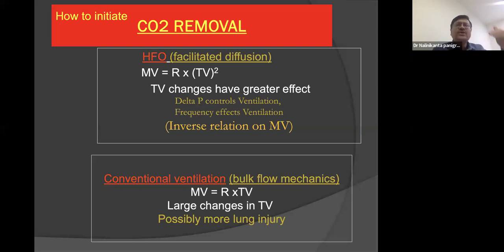You review the previous MAP, how much have you used? Decrease MAP by 1 cm or 2 cm. Then further wait. If there is no further deterioration, and FiO2 is further decreased, you can go with the decreased mean air pressure. So when you get a mean air pressure and oxygenation improvement starts, you go on decreasing the FiO2 till it reaches 60%, then you decrease your mean air pressure. That's the way we normally handle oxygenation.